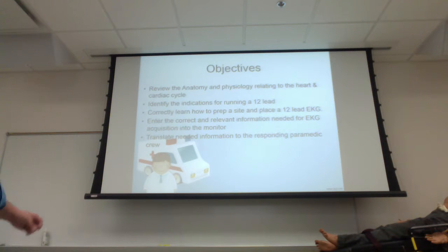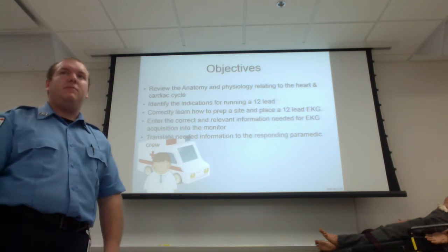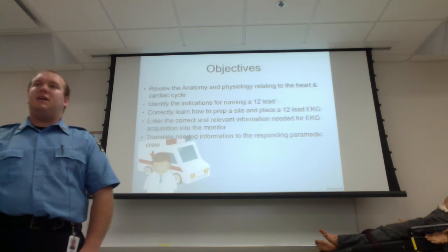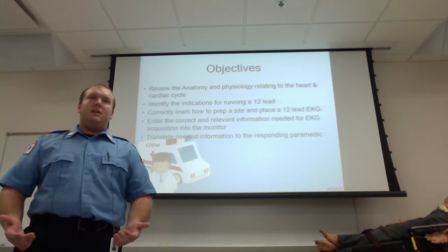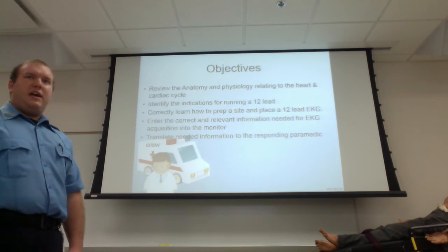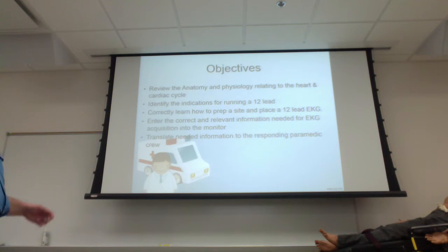We're going to look thoroughly at how to prep the sites and place an EKG on a patient. The way you've probably seen it done before, different medics come up, pull the stickers out, the electrodes, and just slap them on the patient. There can be a lot more prep that goes into that and actually gives you a better quality reading than the trashy, very staticky reading that you see a lot of times. So we're going to look at that as well.